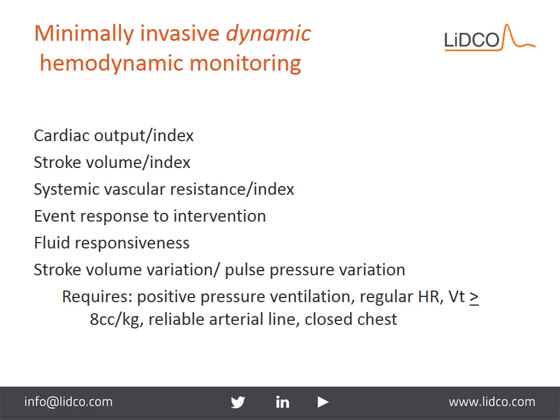And because of that, you can see an event response to an intervention such as a fluid bolus, titrating an inotrope, or perhaps a vasopressor, as the patient physiologically is experiencing it.